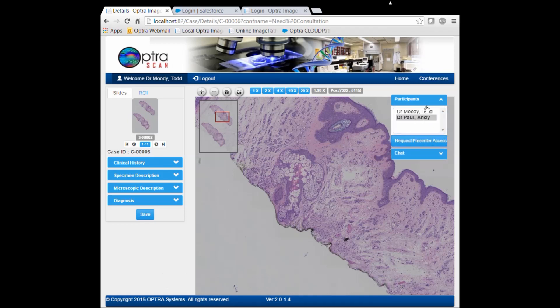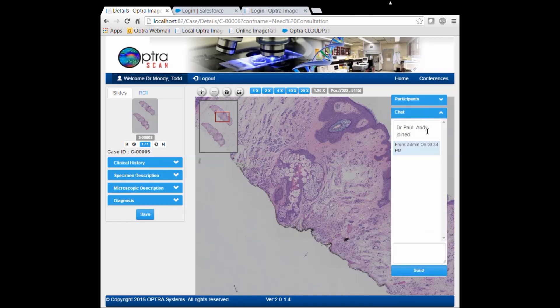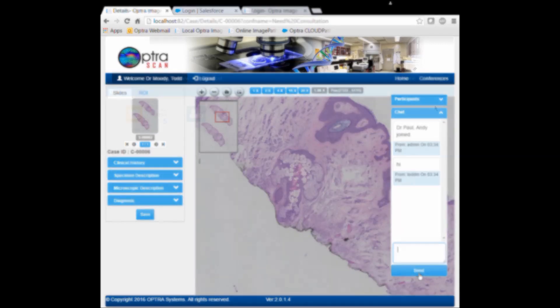After the pathologist offers concluding remarks to the case, the technician can print an automatically generated report to be signed off, and the case may then be closed and archived.